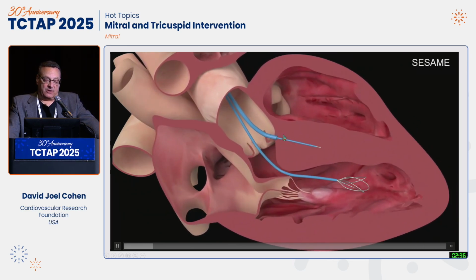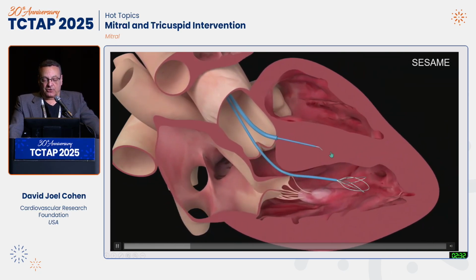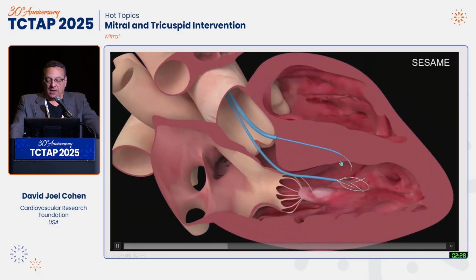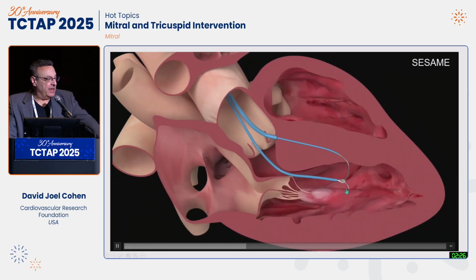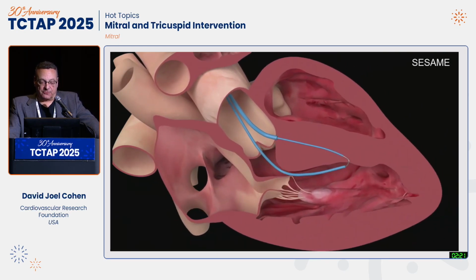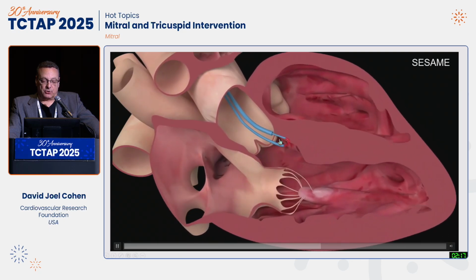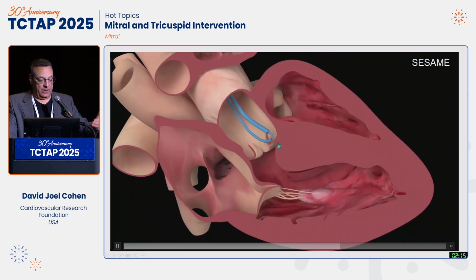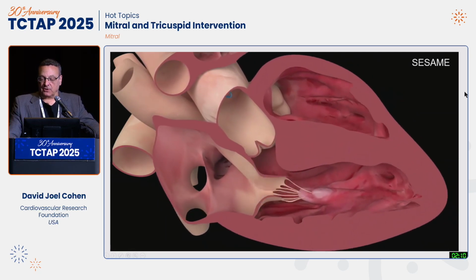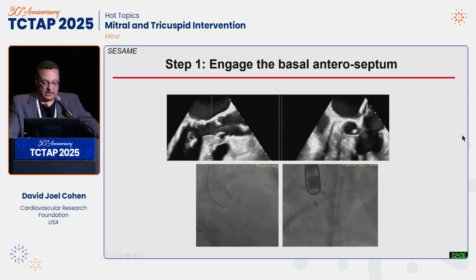We have already penetrated into the intraventricular septum with an electrified wire. And now we are just steering the wire under fluoroscopy through the intraventricular septum. And then we re-enter the left ventricular cavity where we have a snare parked. We snare the wire. We externalize it just like we do for BASILICA or pretty much any electrocautery, electrosurgical procedure. Then we electrify the wire and we pull it back gradually and we create a slice through the intraventricular septum.